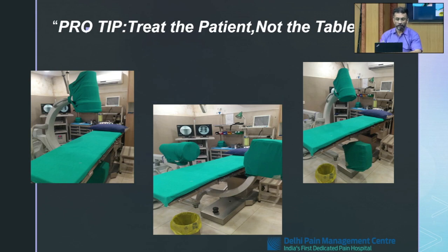Now, there are three basic images: one is AP, one is lateral, another is oblique. Now, the C-arm position or the table position will not decide the AP. This is a common argument that I have with my technician, who says, sir, zero is showing. But zero doesn't cater, because there is obesity, positioning, skeletal deformities and a lot of other things.